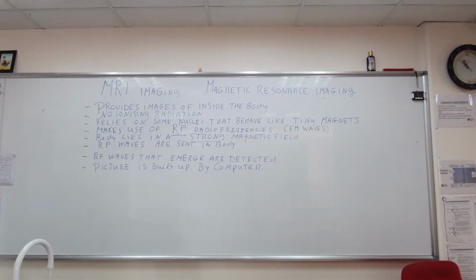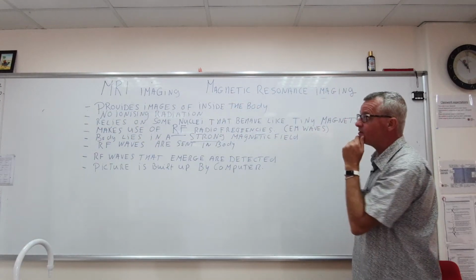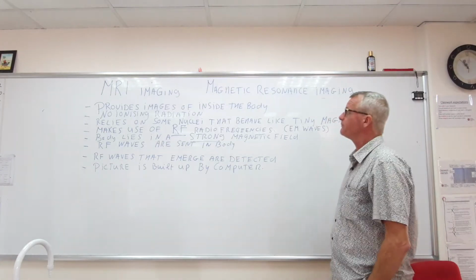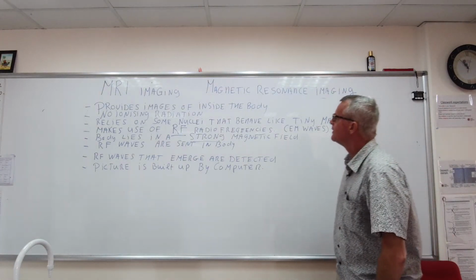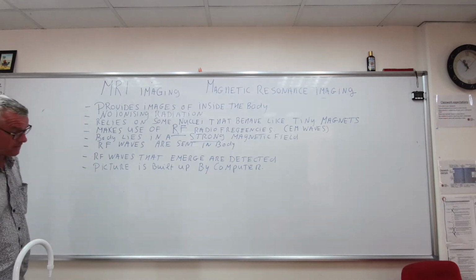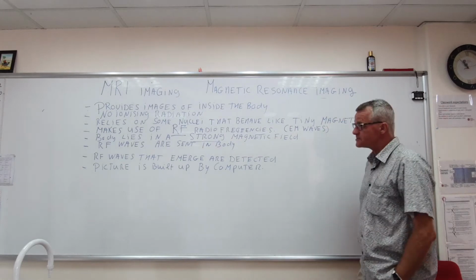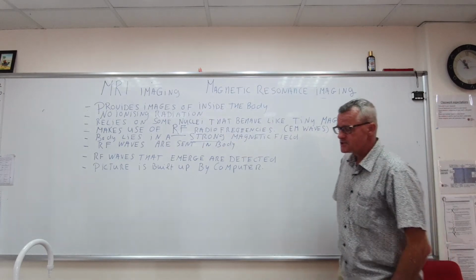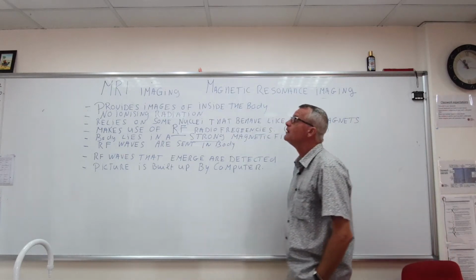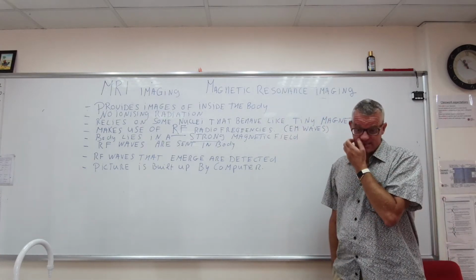Good morning, everybody. Today we're going to talk about MRI imaging, magnetic resonance imaging. You will understand later why we use the word resonance. Just some features. MRI imaging provides images of inside the body.